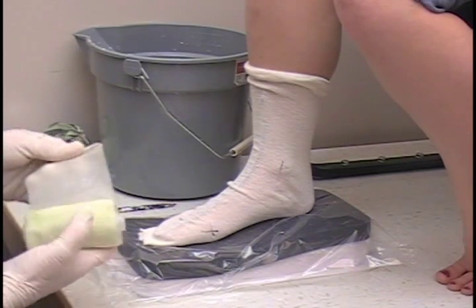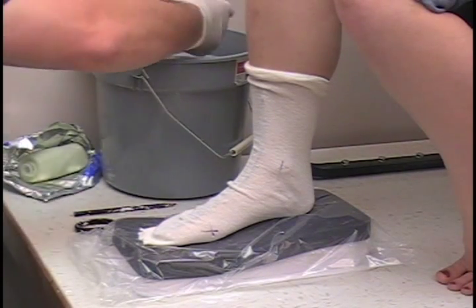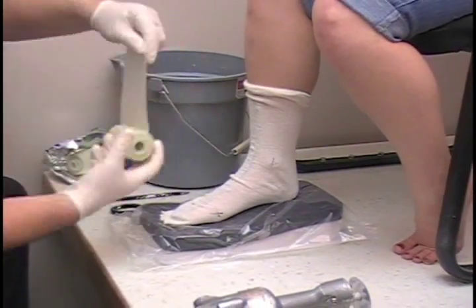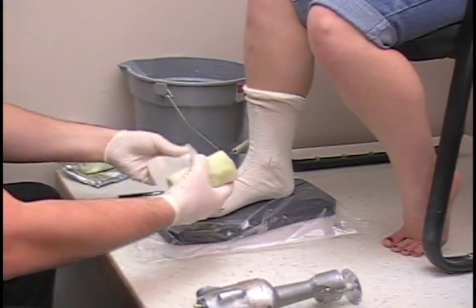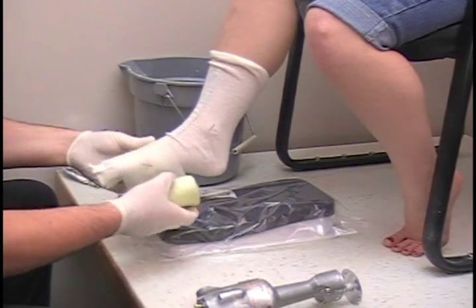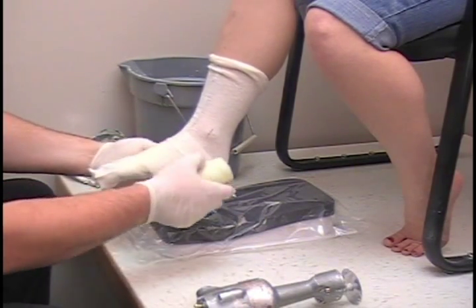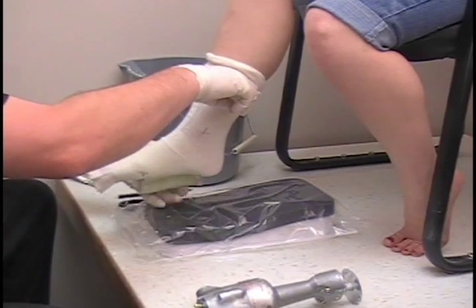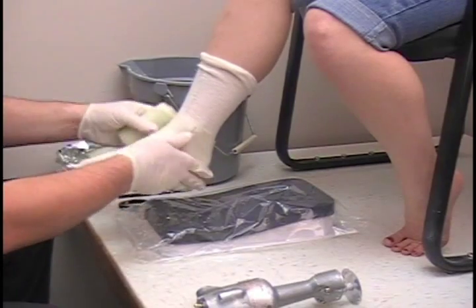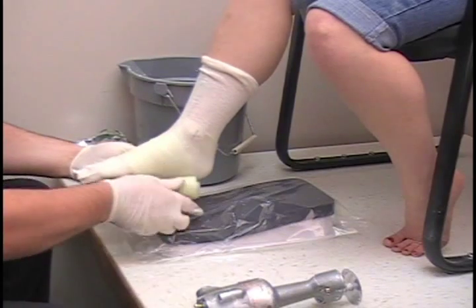We're going to use fiberglass tape — just get it wet real quick, and get most of the water out — and have the patient bring the foot forward to you. For this, we're doing a gauntlet. We need an 8-inch cast, so we need to go about 8 inches high, but we don't need the toes, so you don't have to worry too much about encapsulating the toes unless you're doing a full-length gauntlet.